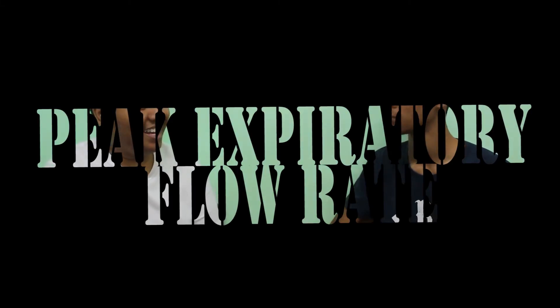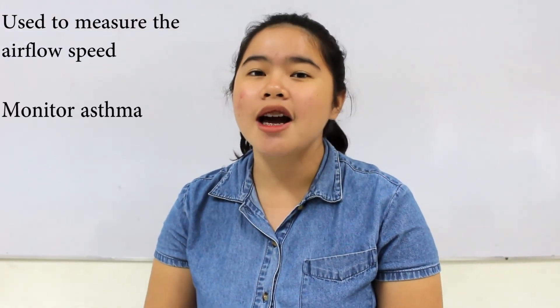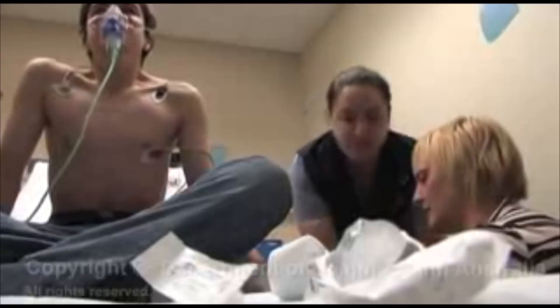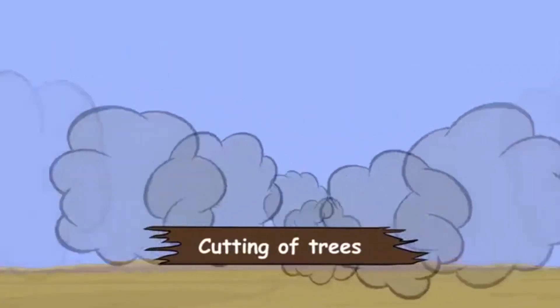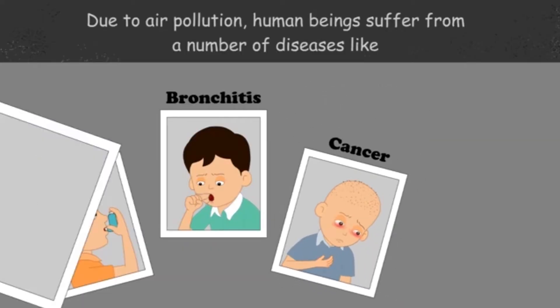Demonstrating Peak Expiratory Flow Rate. PEFR, or peak expiratory flow rate, is used to measure airflow speed. This is used to monitor asthma, to monitor the effects of ozone and air pollutants on respiratory function, as well as for chronic obstructive pulmonary diseases.